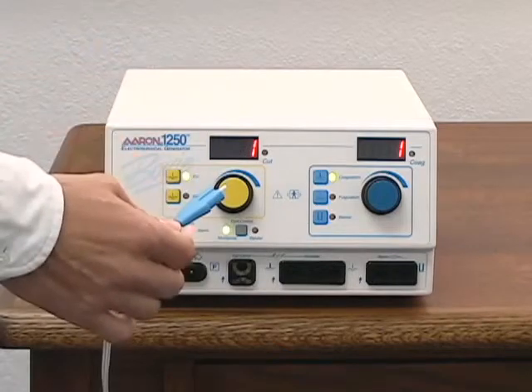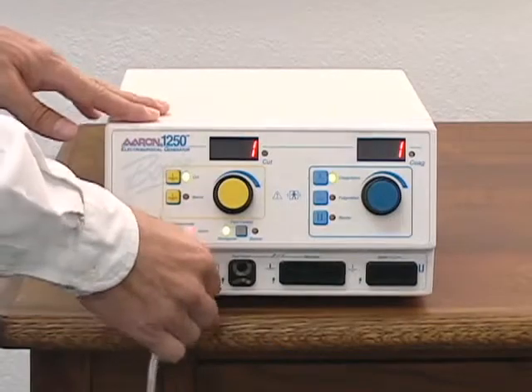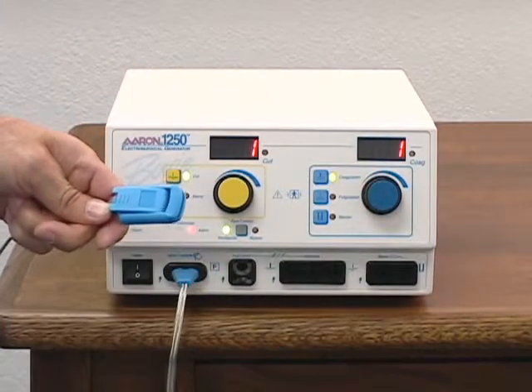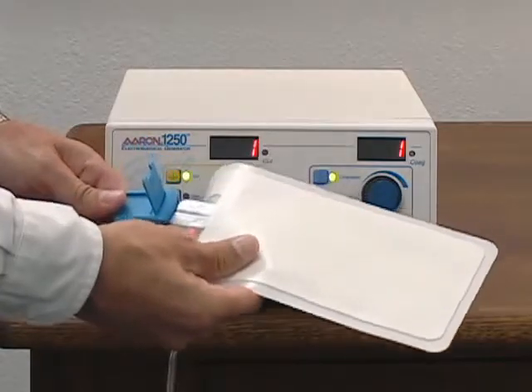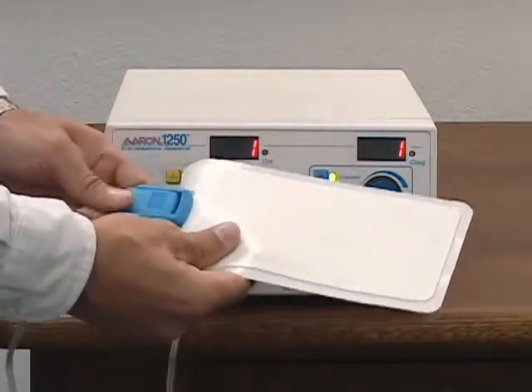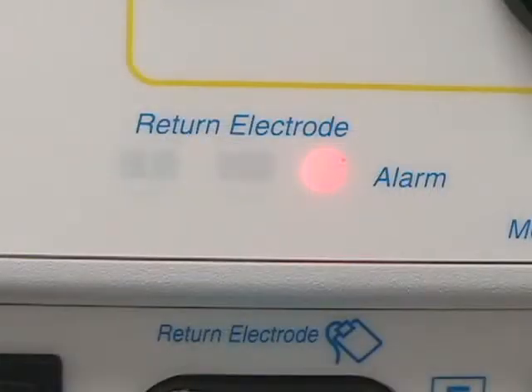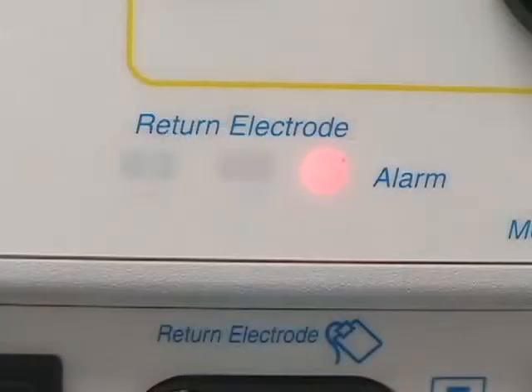To install the cable, insert the plug into the receptacle marked return electrode. To attach the pad to the cable, open the locking mechanism, insert the tab into the clip, and close the locking mechanism. The return electrode alarm indicator will remain illuminated due to BOVI's NEM pad sensing technology. Once the pad is securely attached to the patient, the alarm light will go out and the split pad icon will be lit.